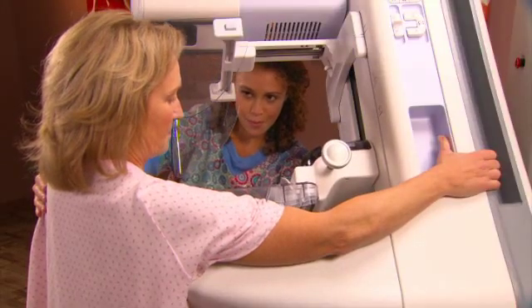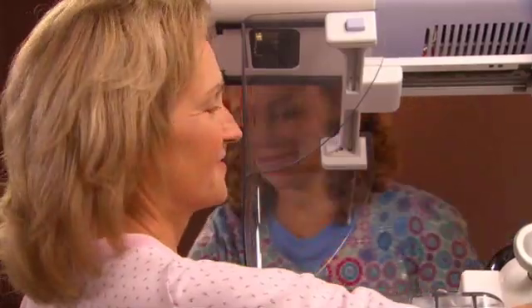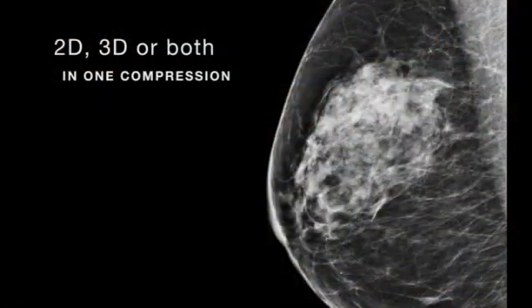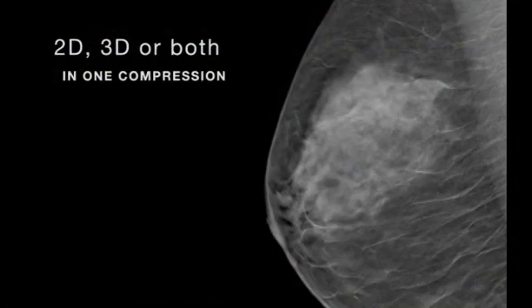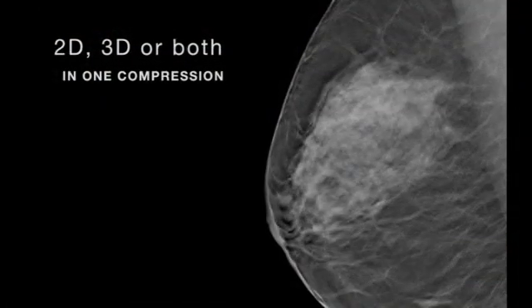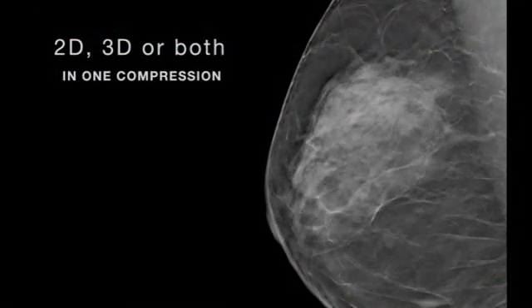The system is designed to perform mammography exams using either 2D or 3D, or both in one compression.